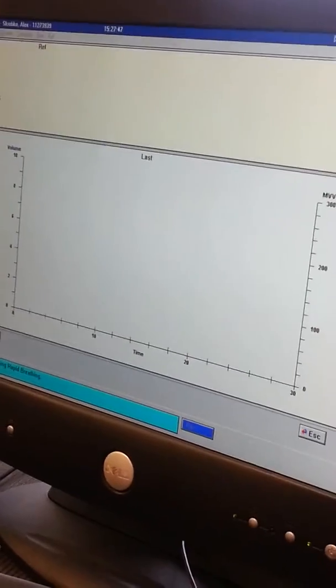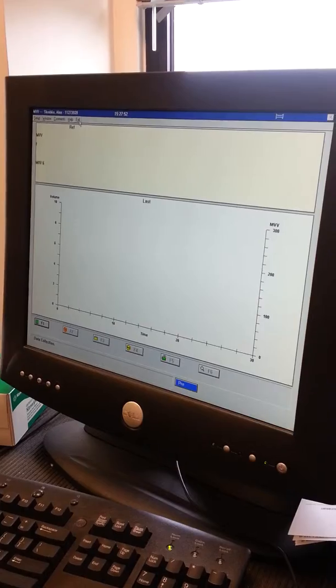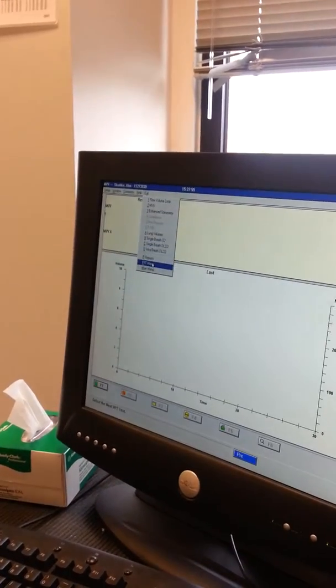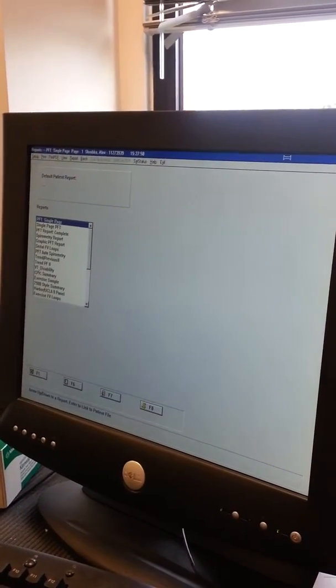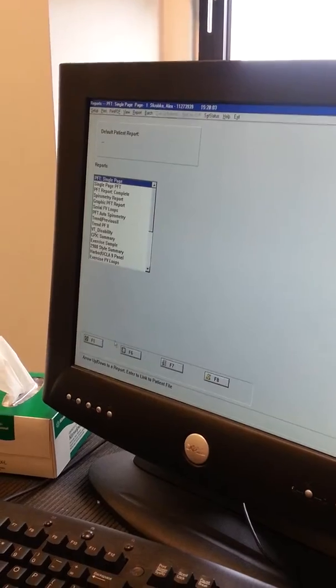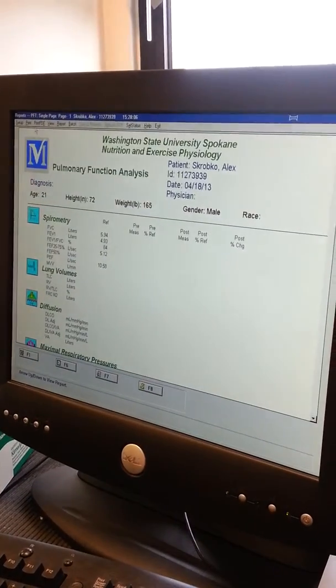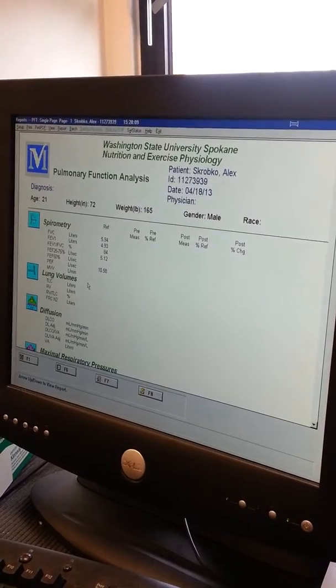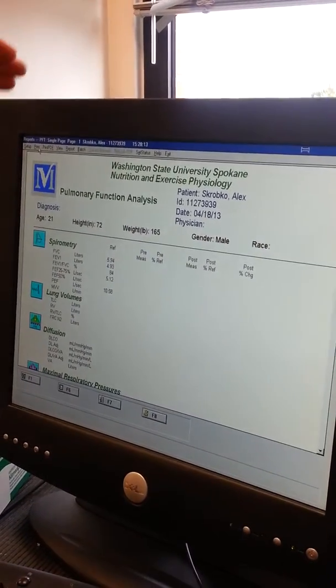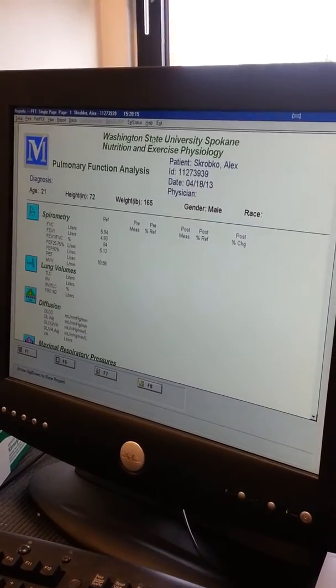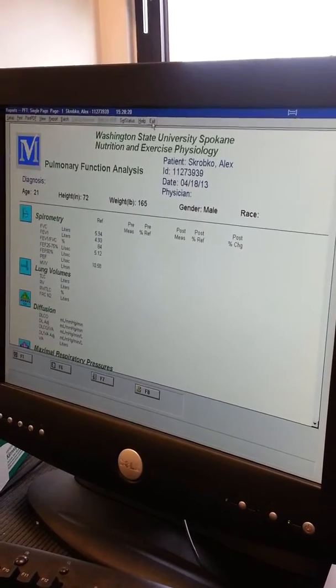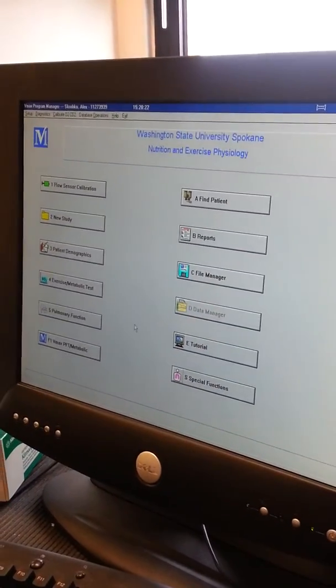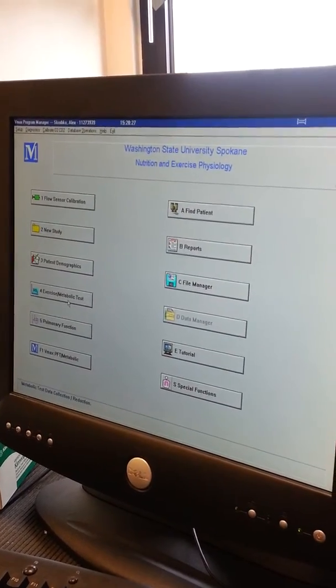After you're done with that, you push exit again and go down to reports. Click on this one - PFT single page - and then you print. So we're gonna print some nothing. Then you go to number four.